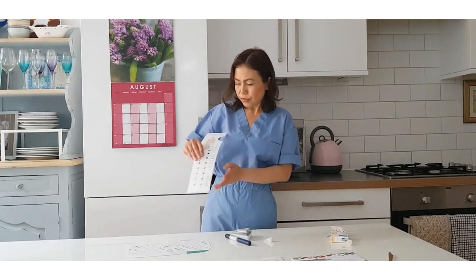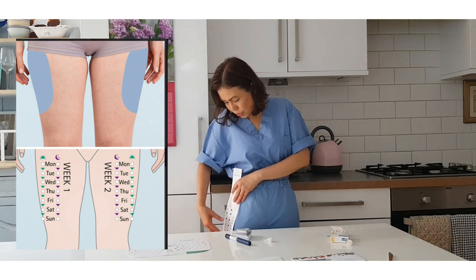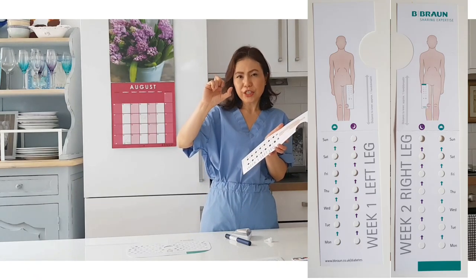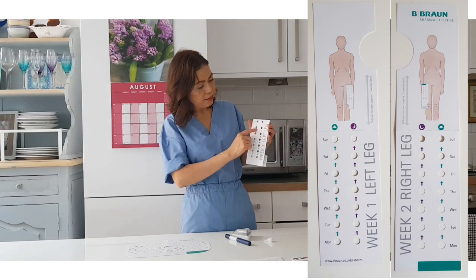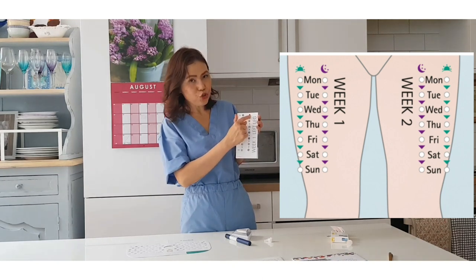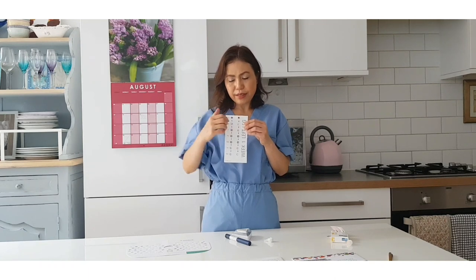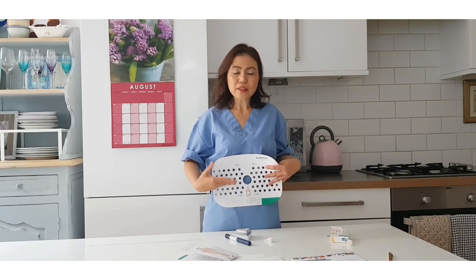Similar with your thigh - look for the fatty side around your thigh, both legs. Imagine you have 14 polka dots here. It's about almost an inch from the last injection. For example, Sunday you start here, then Saturday, Friday, and then Monday from the bottom - or if you like, you can start from the top. So you just give an inch distance from top to bottom and an inch distance in between.